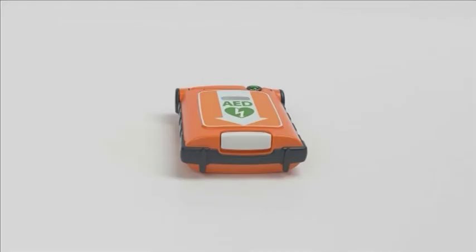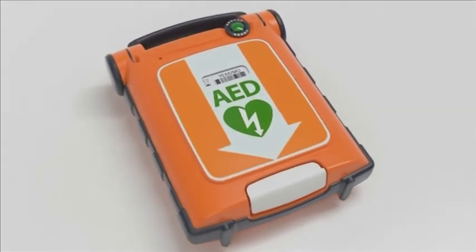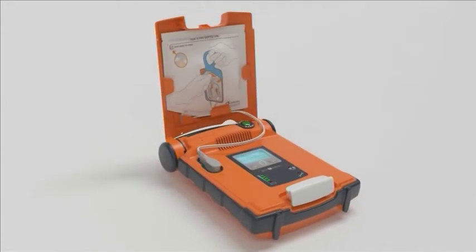not deep enough. If there is no green package in the lid with the CPR device and only standard electrode pads are connected, the AED will still guide you through how to perform CPR, along with the metronome for 30 compressions as well as the 2 breaths. The only difference is that the AED will not give you feedback during CPR.